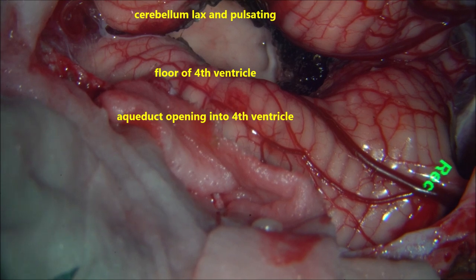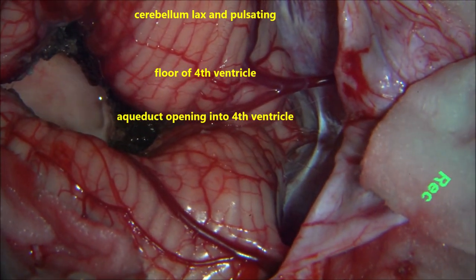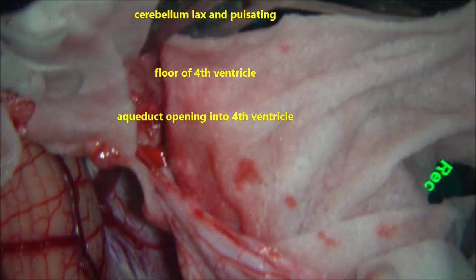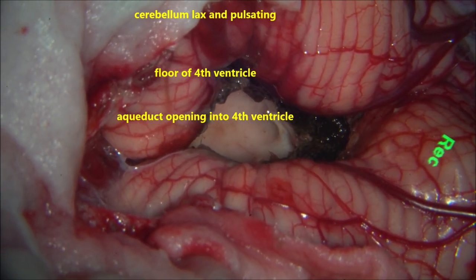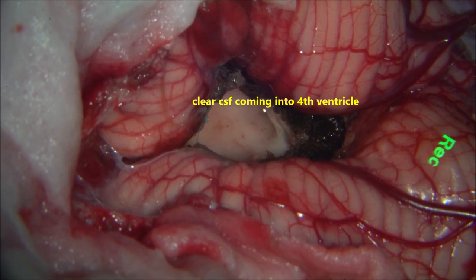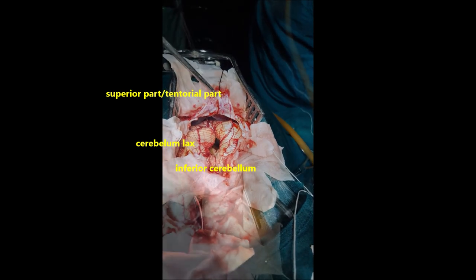Complete excision is confirmed. The aqueduct is seen clearly and the CSF is perfectly clear with no blood. That is the superior part of the cerebellum — the tentorium is seen, the inferior part of the cerebellum, both tonsils are seen, and the lateral part of the cerebellum. After excision of the tumour, the cerebellum has totally collapsed and there is a significant amount of space all around the cerebellum. The CSF is flowing very well. You can see the tentorium and the tentorial surface with the superior part of the cerebellum.